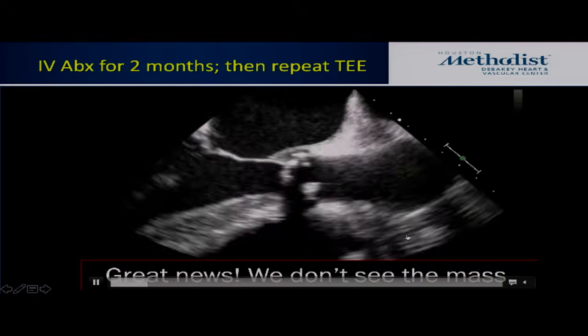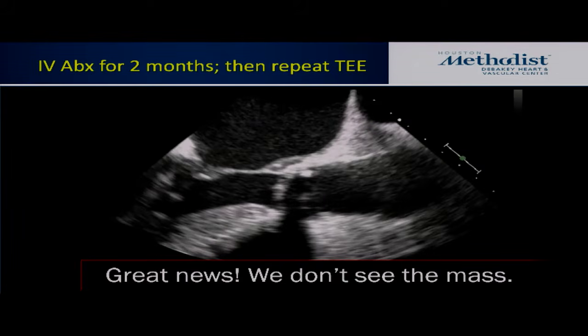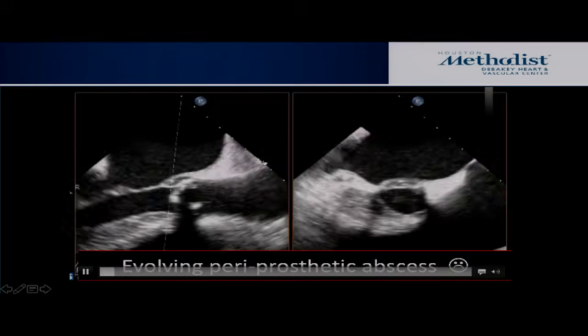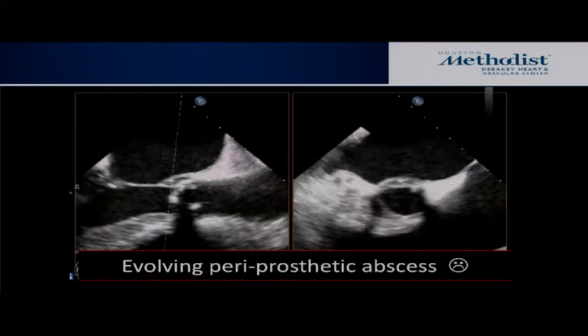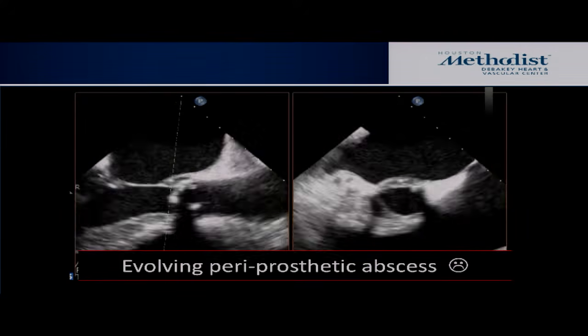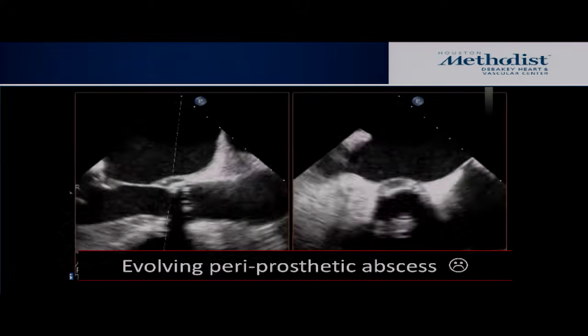And we feel great because the lesion is gone. So all kinds of sweeping through, and there's no veggie. So we all feel pretty good. And somebody's saying no. And when you X-plane through this area here, that's really the abnormality. You can see it beautifully here on the side as well. So it has not just thickening, but now we're several months after surgery, and it has a central lucency in the setting of known endocarditis. This is somebody you cannot gain any ground with medical therapy. This is endocarditis requiring surgery.